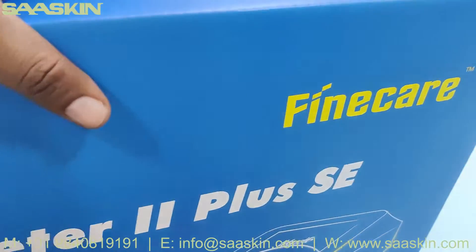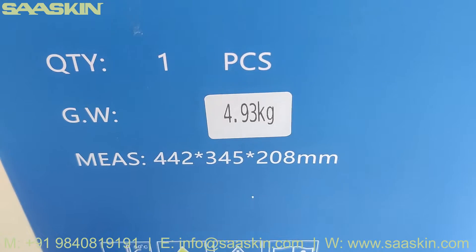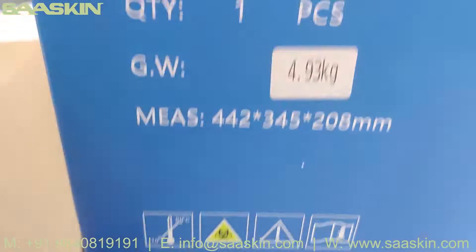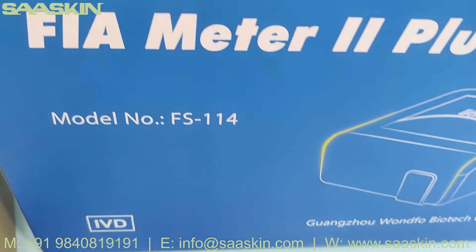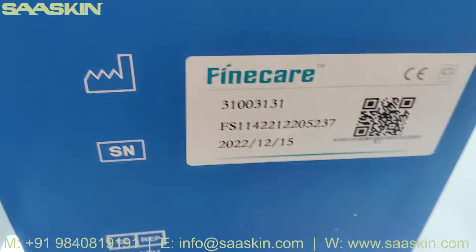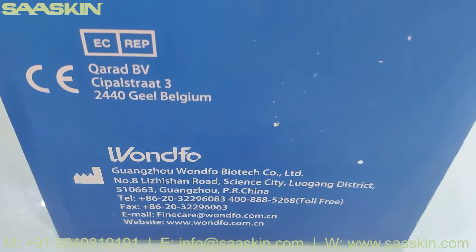You can see I have a certified product. I will just show you around this box. You can see this quantity is one piece, 4.93 kg. The other side has the same information. FineCare FIA Meter 2 Plus. And here on the other side, you can see it says FineCare. There is a serial number and manufacturing location.